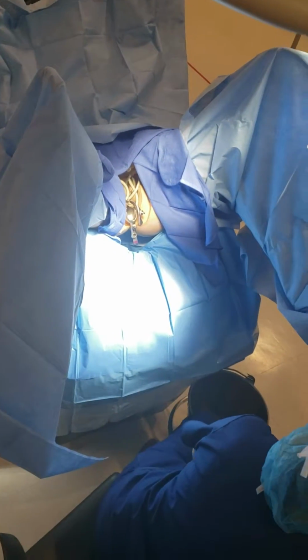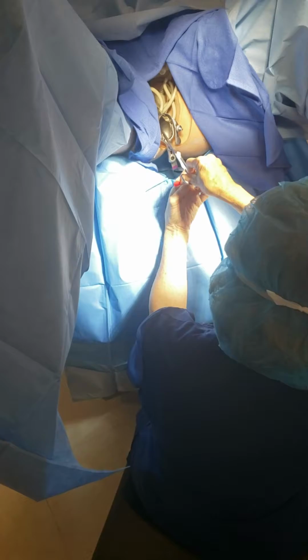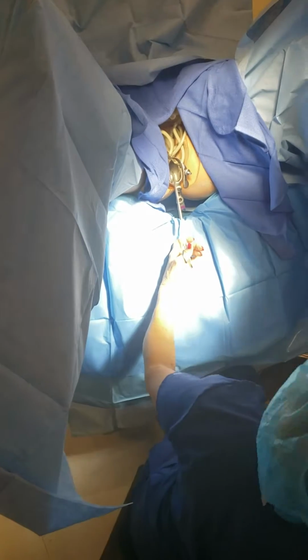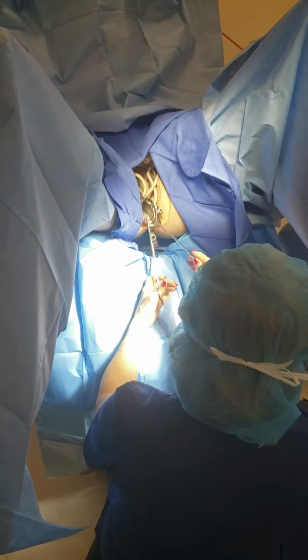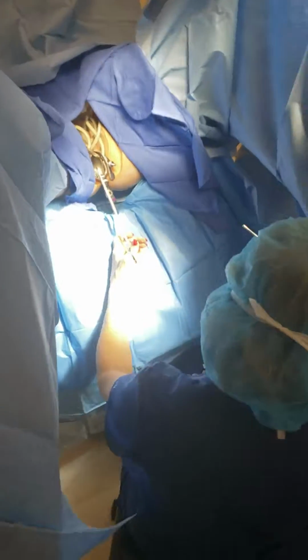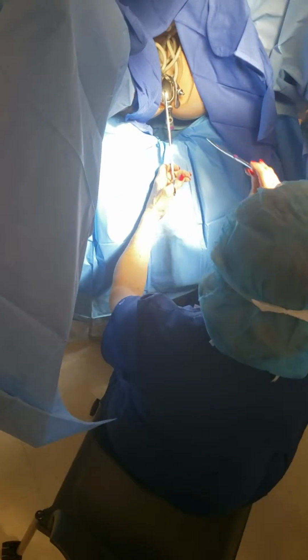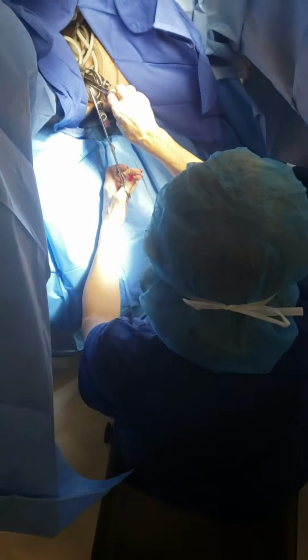Okay, so I'm gonna take my tenaculum, reach in, grab the cervix, and pull out so that you're looking right at the cervix. Then I am going to do a depth sound, see how big it is, and she's gonna look at it, because it usually has little markings on here. So it's a 10. I'm gonna start with this one, then I'm gonna dilate, and I'm gonna use another one. They don't usually use all of them.